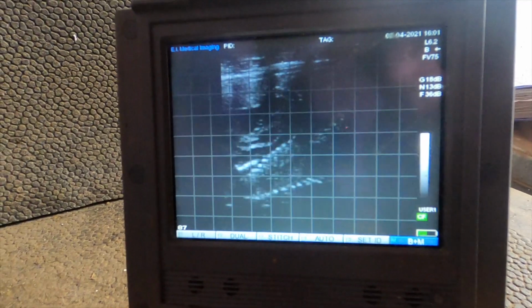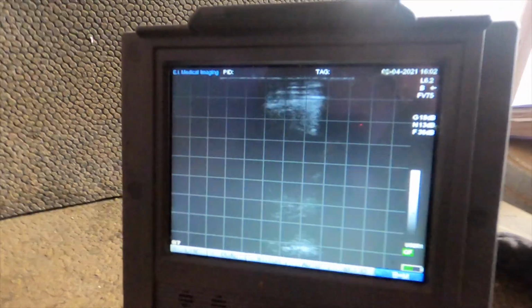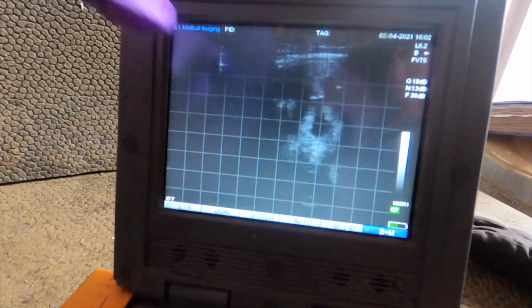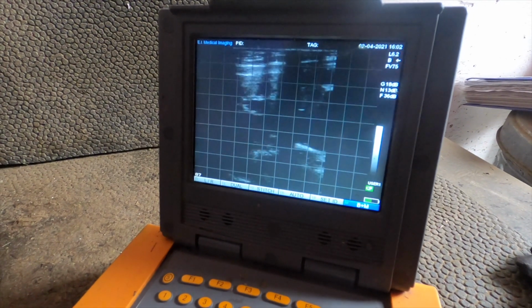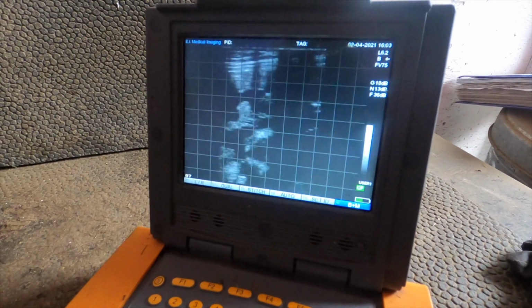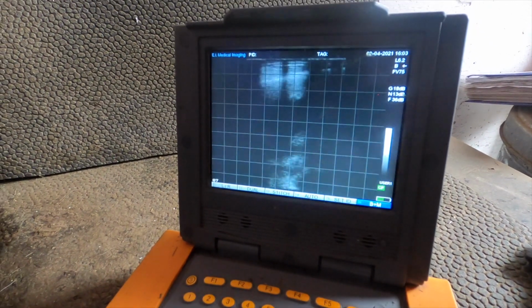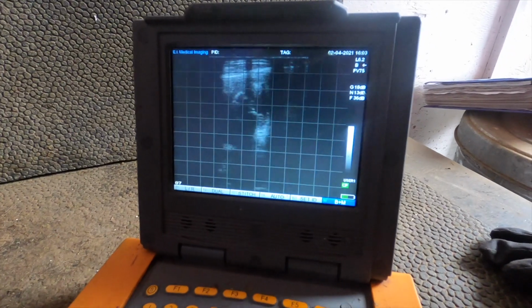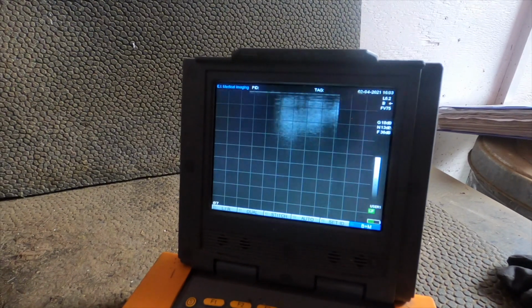There's the rib cage. Oh, there were two. So rib cage, and we go back in the goat. This is the head of another one. There's the skull. Okay, there's another head, in a totally different location. Oh, so there's three? No, there's two so far. One head right there. Come around here. There's another head right up there, that little circle. Exactly. So you've got two in there for sure.